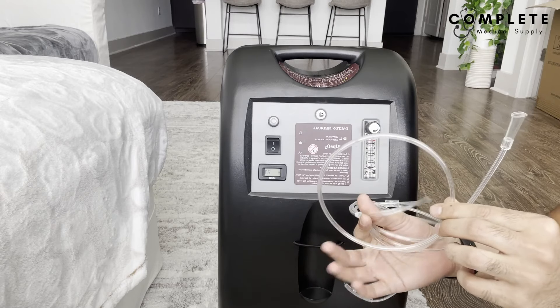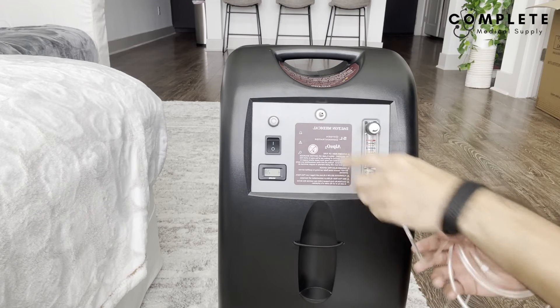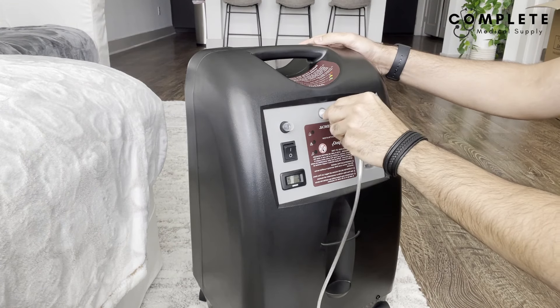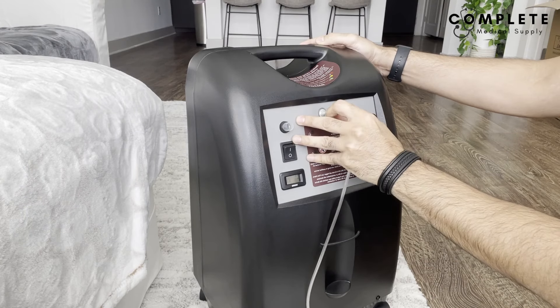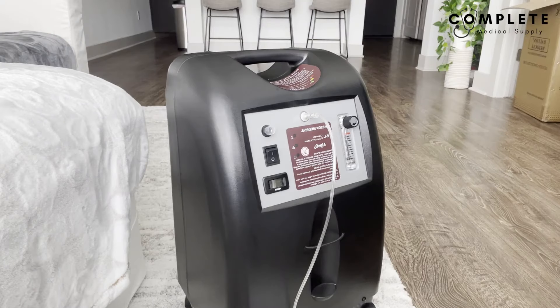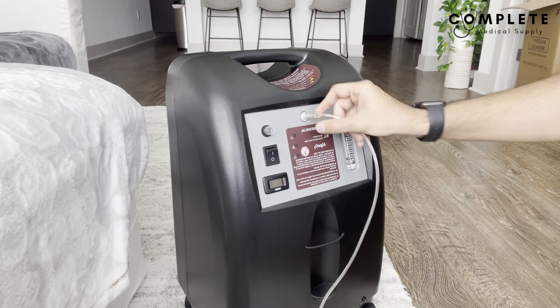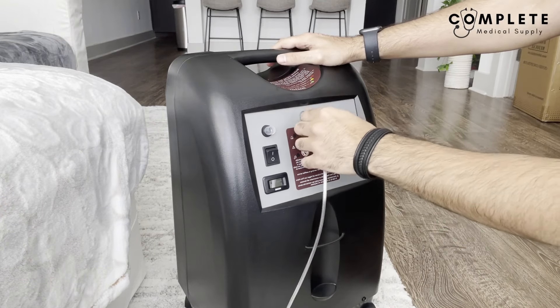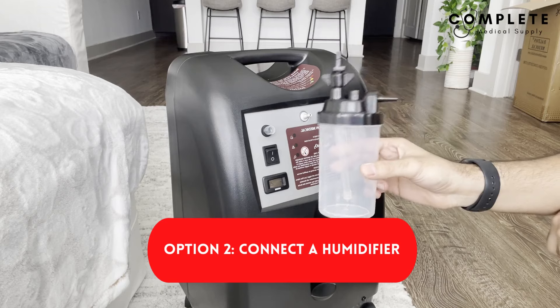For turning on the machine, let's set up everything that goes with it. The nasal cannula tubing — and you can also get a mask — has a universal connector that should fit the output. Take the end of the tubing and push it all the way in, making sure it's seated fully to the back, because if it's not in far enough it might leak or you might not get enough oxygen.